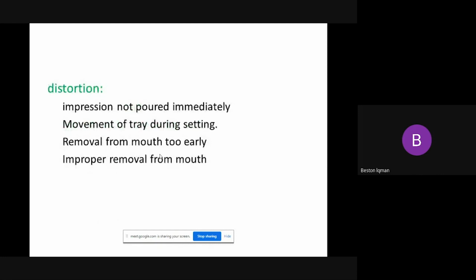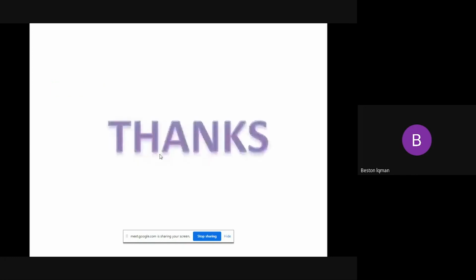Distortion. The impression not poured immediately, number one. Number two, movement of the tray during setting. Removal from the mouth too early. Improper removal from the mouth. All of them can cause distortion. And thank you.